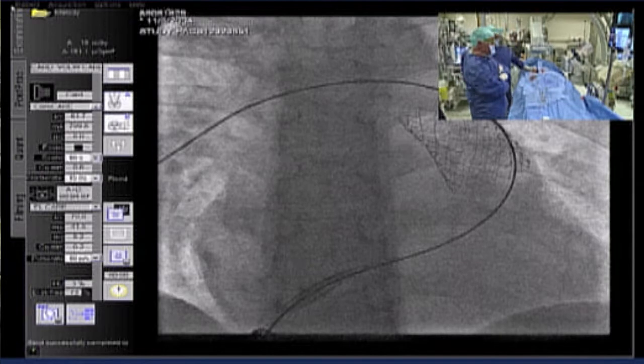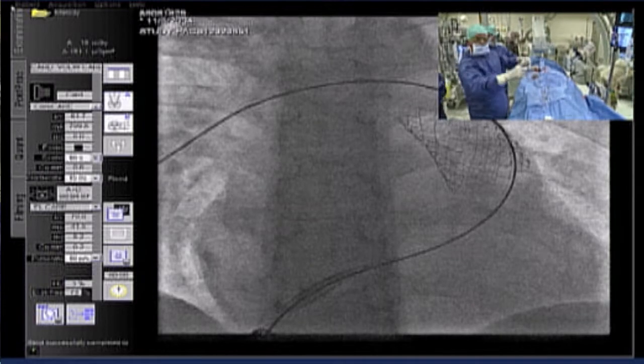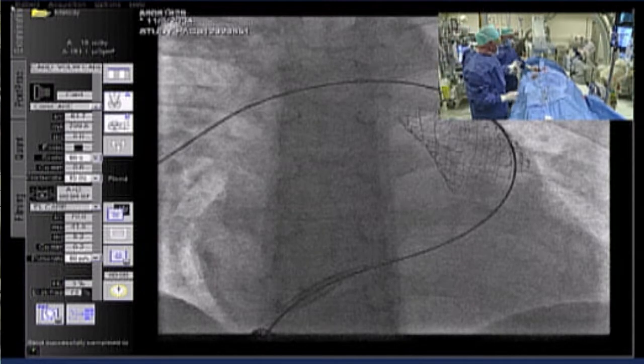It's not good. We can't see the lateral. Show the lateral, show the B. We come out again.